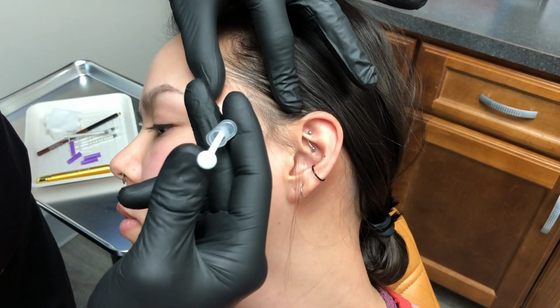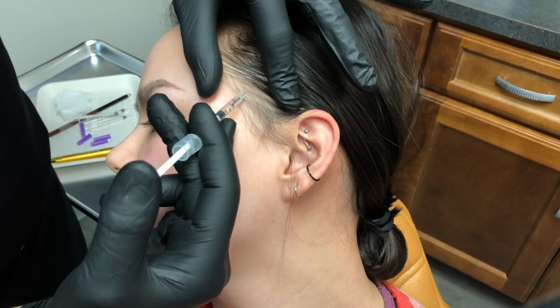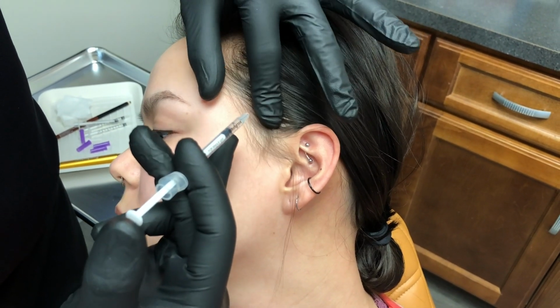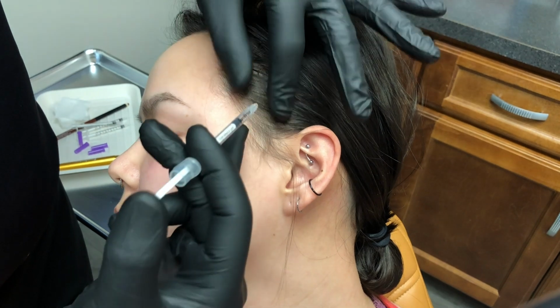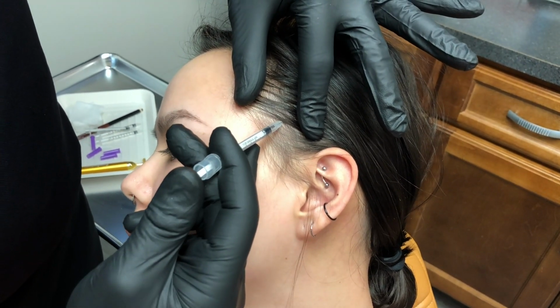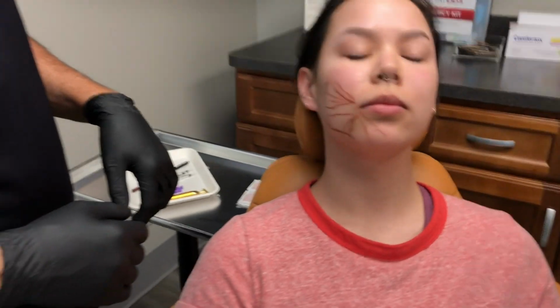This I'm going to get to place and aspirate. It's in a much more delicate area, and I want to give one more. Bite your teeth together again for me. I want to go right up here and aspirate. And again, you must know your anatomy, you must know what you're doing there, and that is the entire treatment she is getting for Botox today.